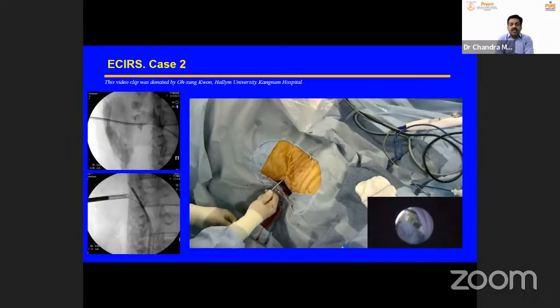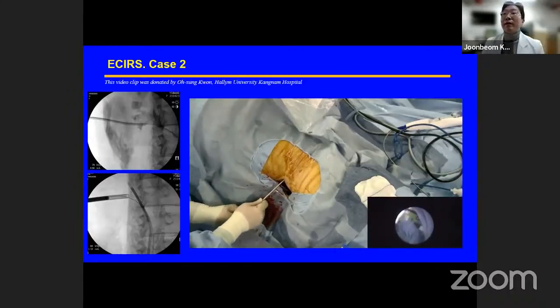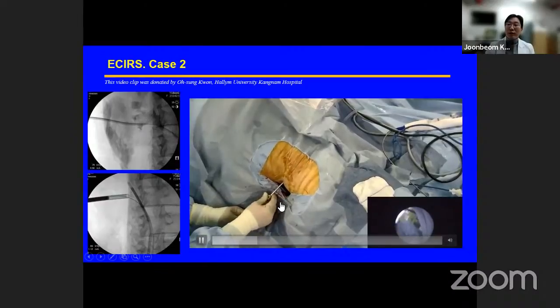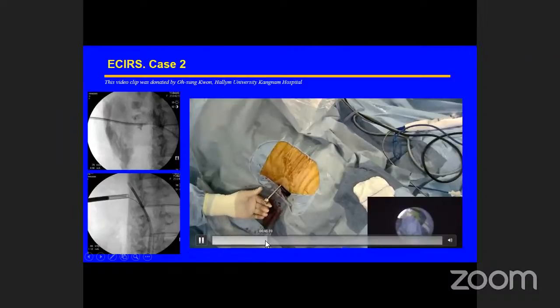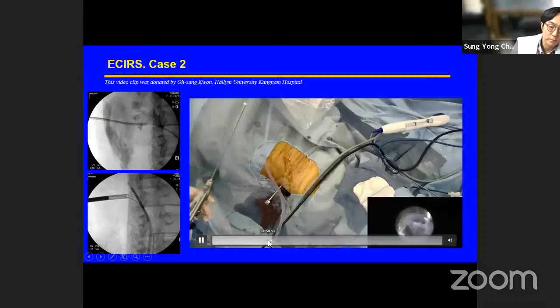You use sequential metal dilators? After the fascial dilator, for me, I use fascial dilators like 10 French and 12 French and then go directly to 16 French. But maybe he punctures directly after the fascial dilatation, when I see this surgery. This is the outer sheath, 16 French. Actually, I think the product is the one-step dilator from Karl Storz. Yeah.